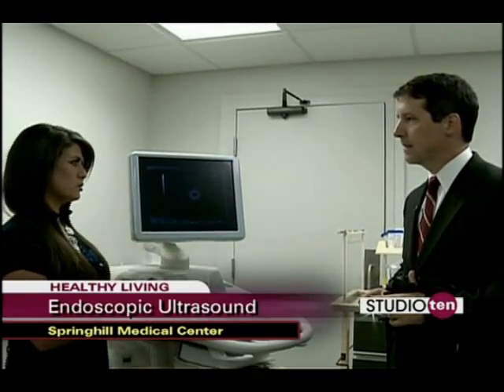Who would be a candidate to get this procedure? Anyone that has any type of GI tumor. A lot of the times we're using this for esophageal cancer, gastric cancer, pancreatic cancer, rectal cancer, and even when visualizing for chronic pancreatitis or bile duct stones.